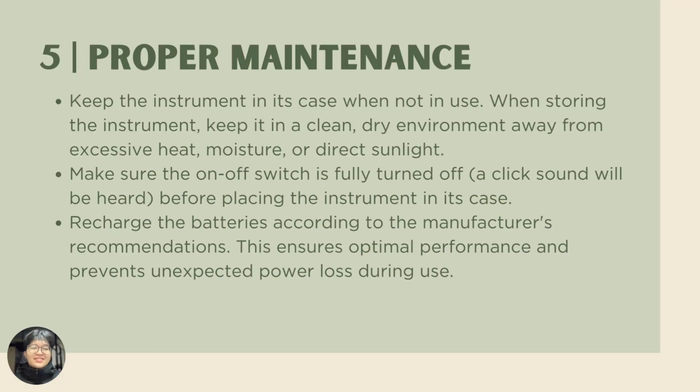Proper maintenance. Keep the instrument in its case when not in use. When storing the instrument, keep it in a clean, dry environment away from excessive heat, moisture, or direct sunlight. Make sure the on and off switch is fully turned off. A click sound will be heard before placing the instrument in its case. Recharge the batteries according to the manufacturer's recommendations. This ensures optimal performance and prevents unexpected power loss during use.